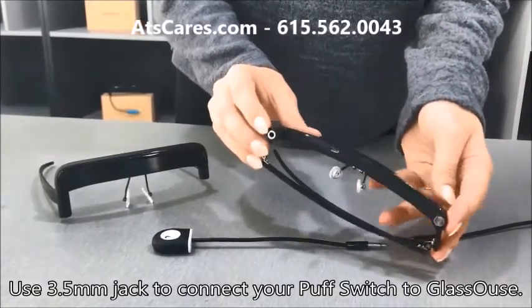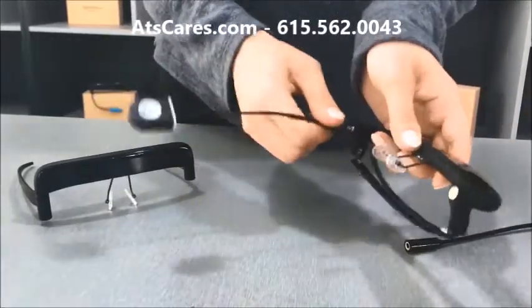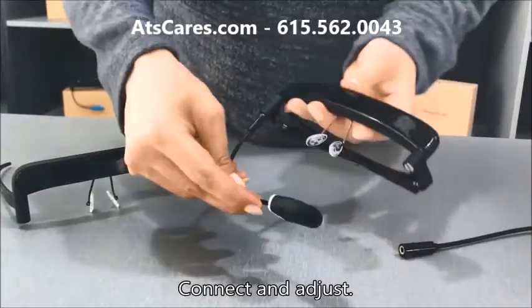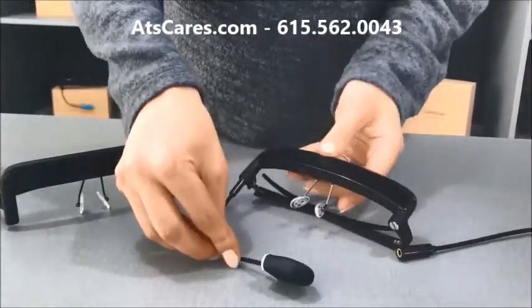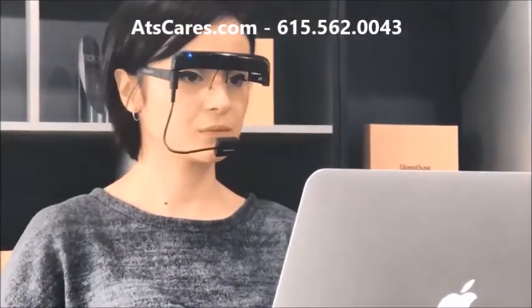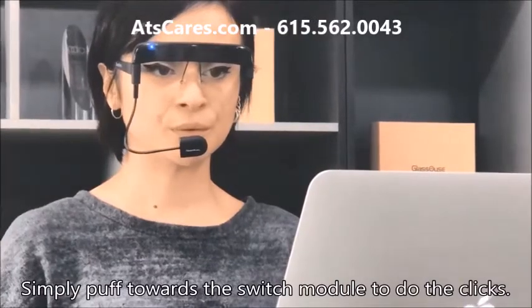Use a 3.5mm jack to connect your Puff switch to Glasshouse. Connect and adjust. Simply puff towards the switch module to do the clicks.